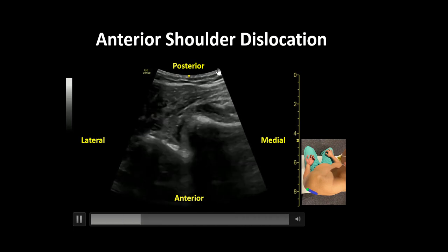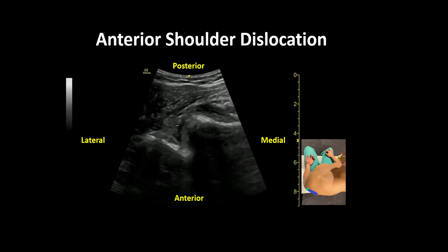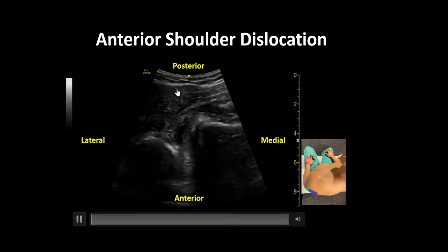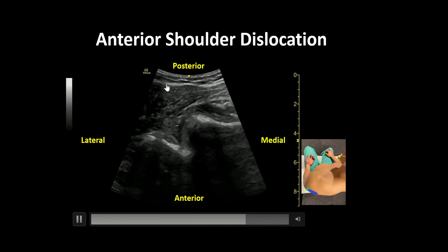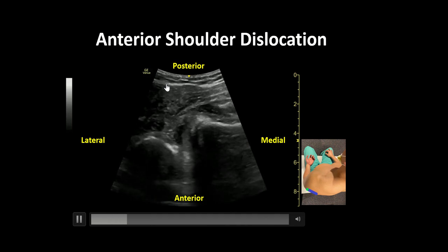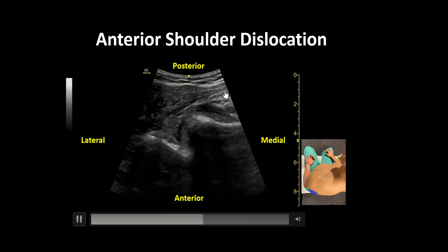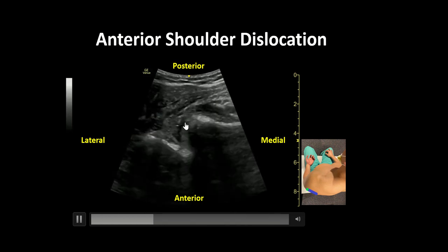To orient ourselves, the near field here is posterior and includes what is closest to the probe. We can see the muscle fibers of the deltoid and infraspinatus.